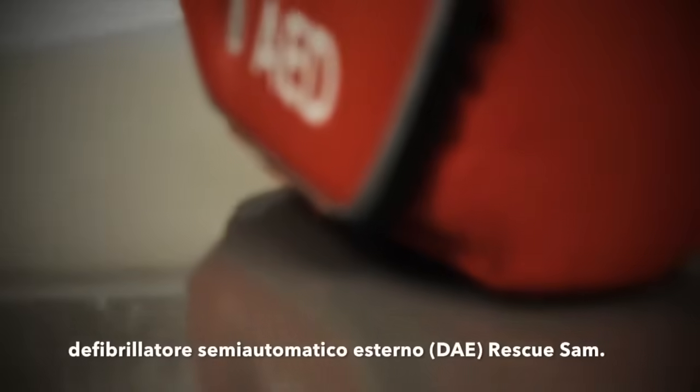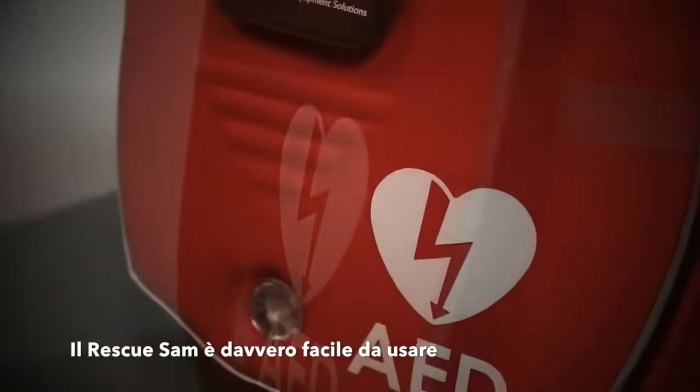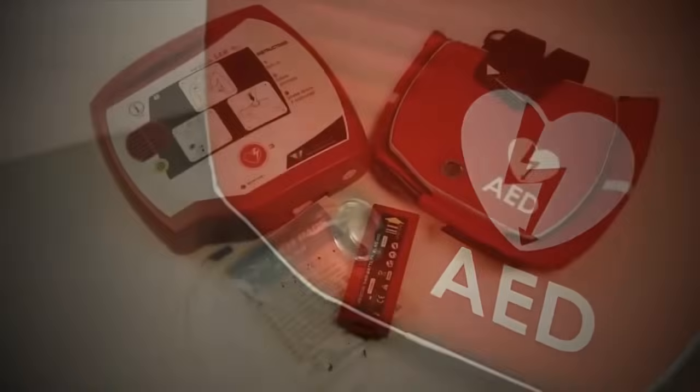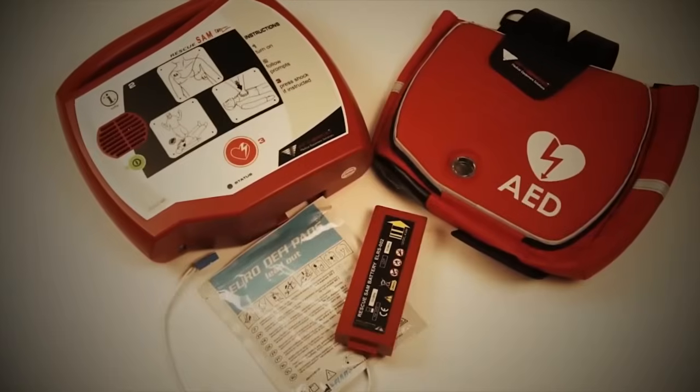Hello and welcome to this short video demonstration on the Rescue Sam semi-automatic defibrillator. The Rescue Sam defibrillator is really simple to use and comes with a protective bag, long life battery and a set of ready to use adult pads as standard.